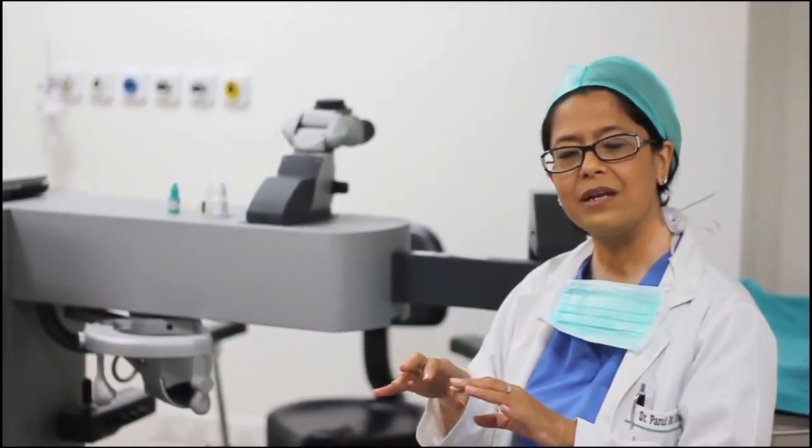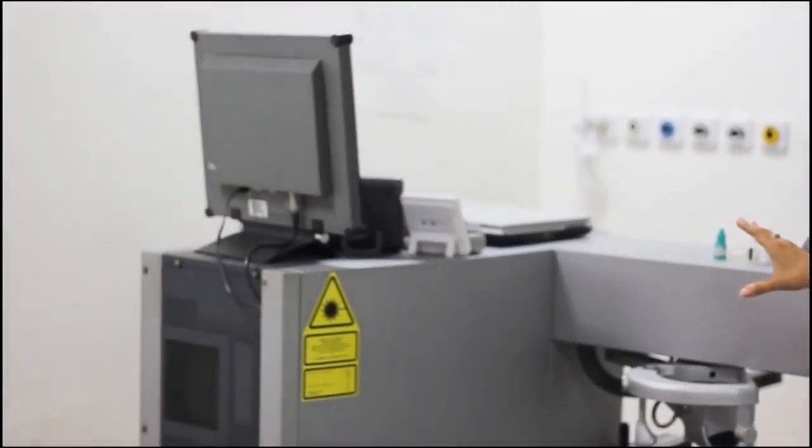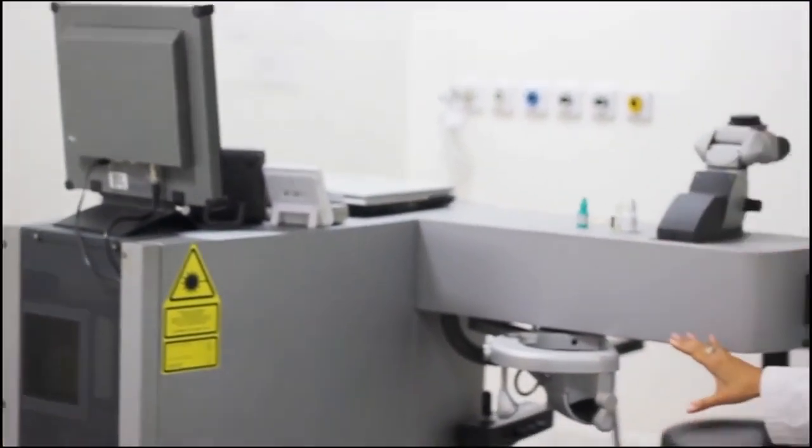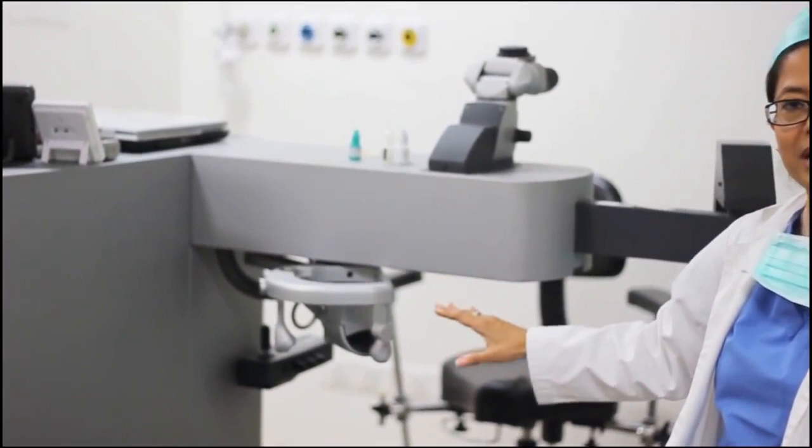Then according to the type of error which you have, which we have already figured in our software here, the machine delivers the laser on your cornea to correct the glasses number.